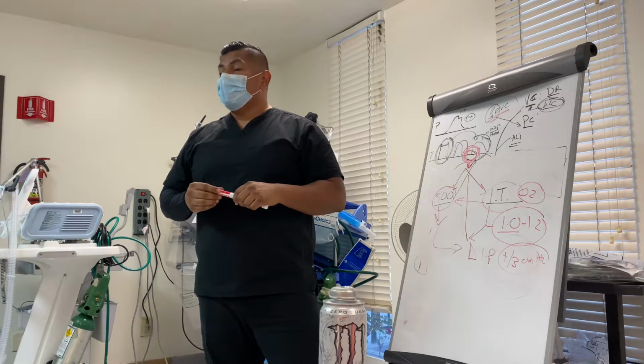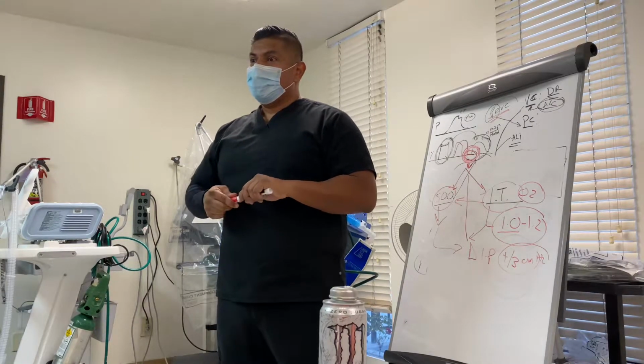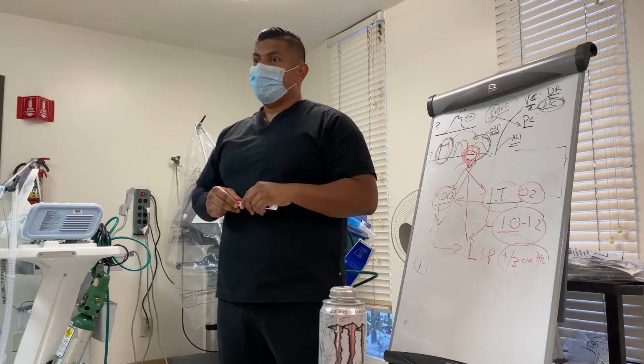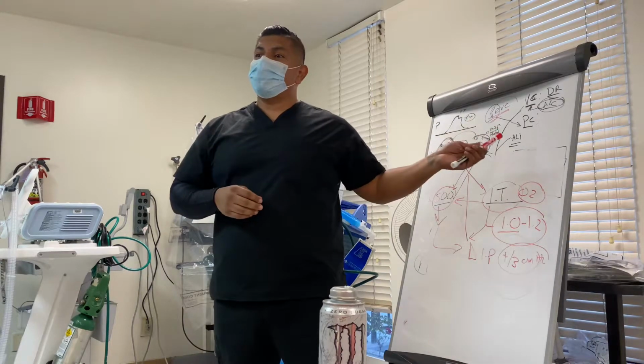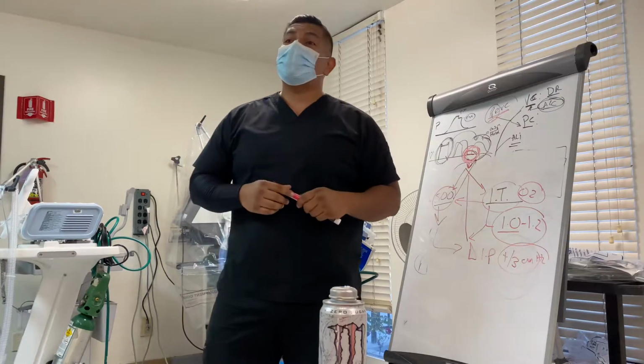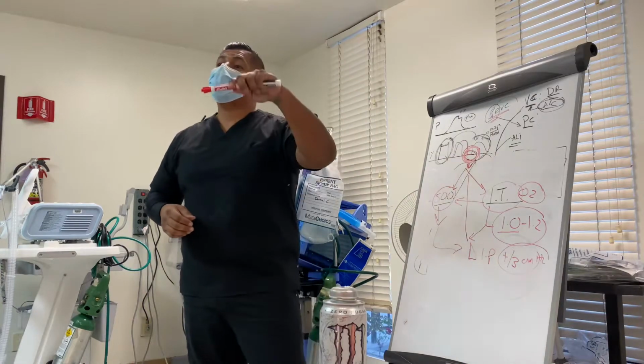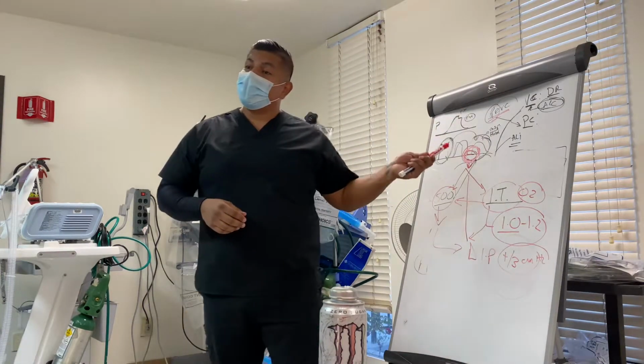So then is there a diagnosis preference? What patients qualify for PRVC? Yes. Everybody. Everybody should be on PRVC. Why is that? Because everybody should have the lowest pressures available to deliver a tidal volume.